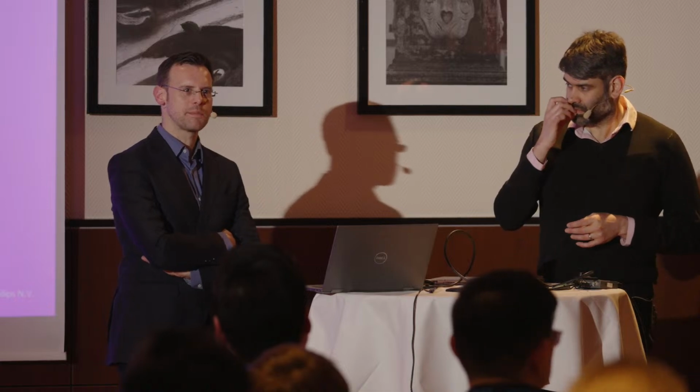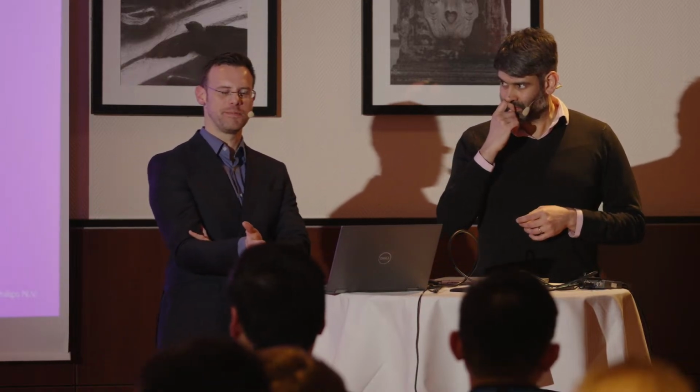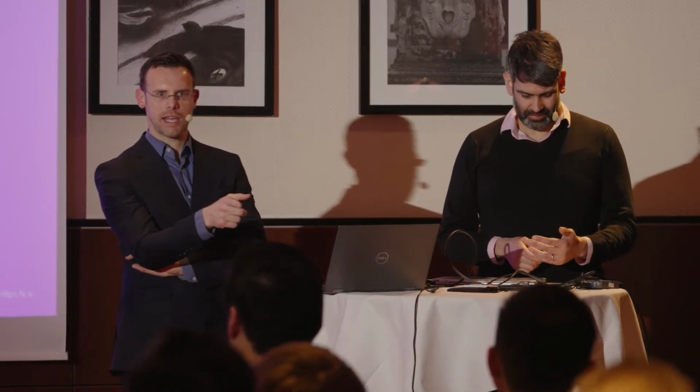Biggest thing I would say is I sometimes forget to record a loop. So I do it all and think, oh, okay, I got the information I want, and I haven't recorded it for posterity. So yeah, you'll see that tomorrow with some of the cases. Don't always have a completion loop on them. But the other thing to mention from what I said is that the catheters that we tend to use are the rapid exchange ones. So you can't actually pull the wire out. So it's more about controlling it as you go forward.